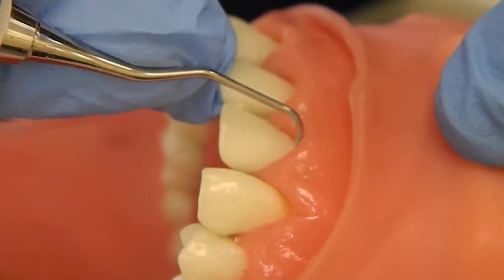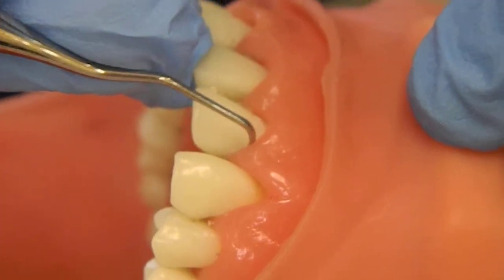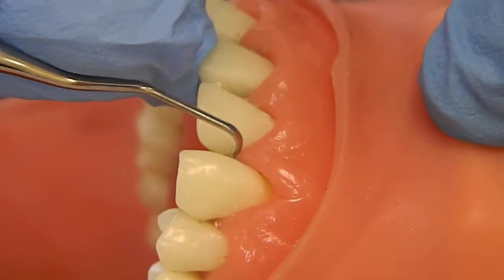Again, walking and blanching the tissue up under the gum line, and ending right here.